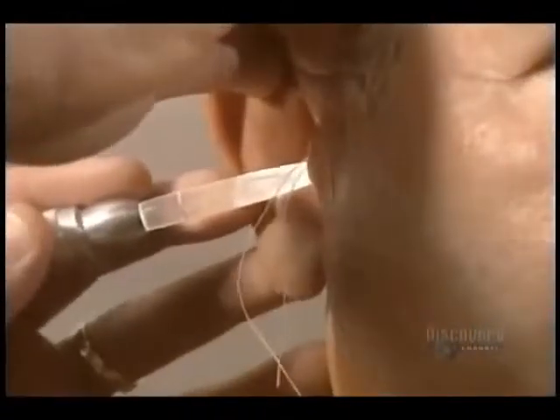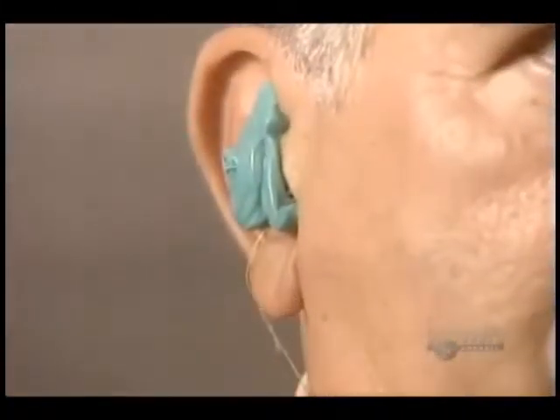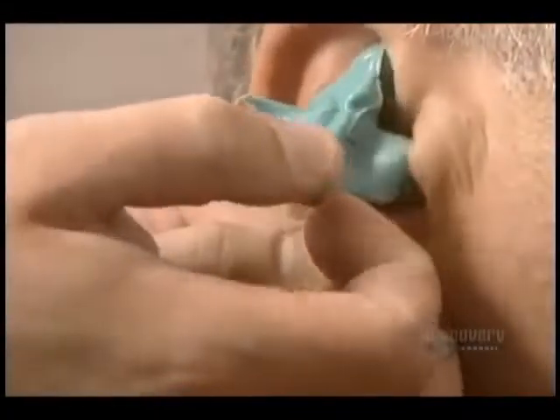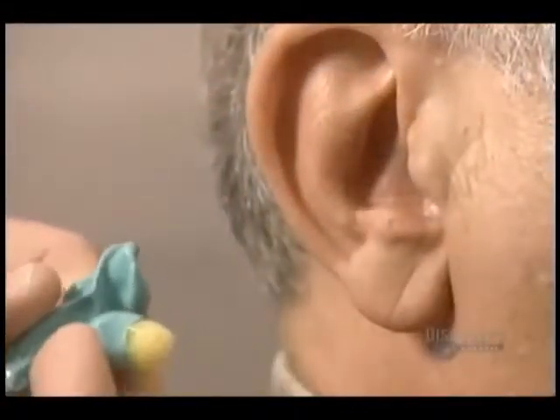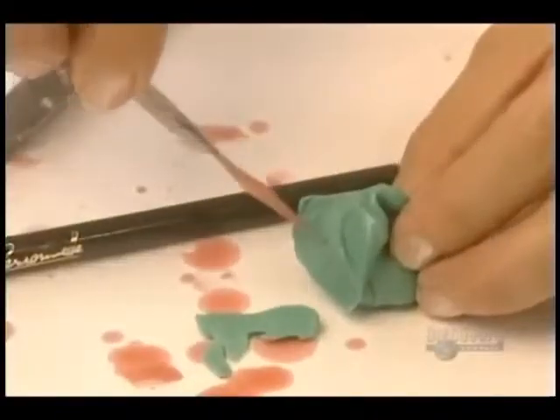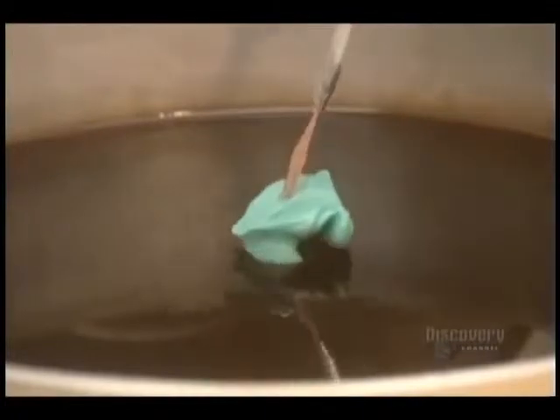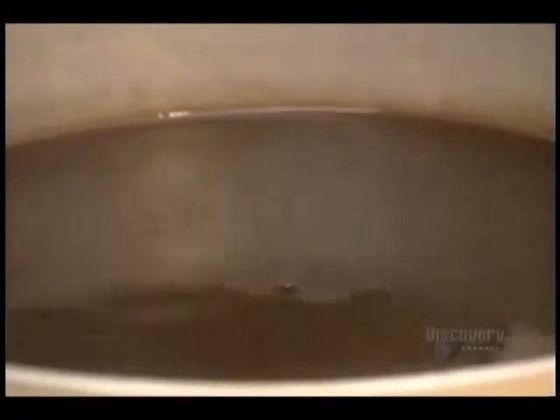To make a mold of the ear canal and protect the eardrum, an otoblock is inserted. Next, a silicone impression-making material is poured in. It solidifies and is then removed from the ear. This congealed mass representing the ear canal is then soaked in warm wax to obtain a positive imprint.